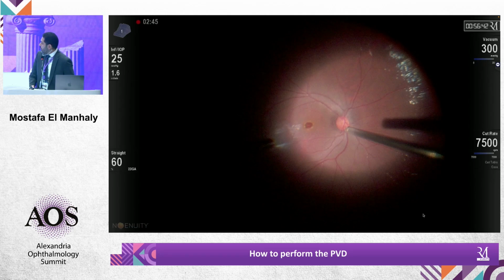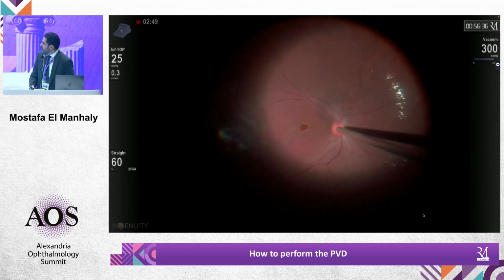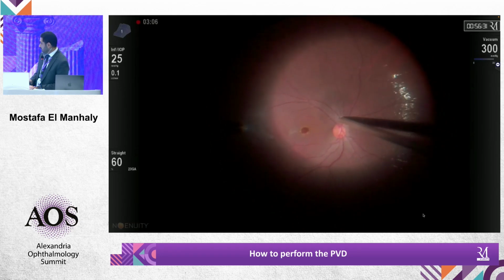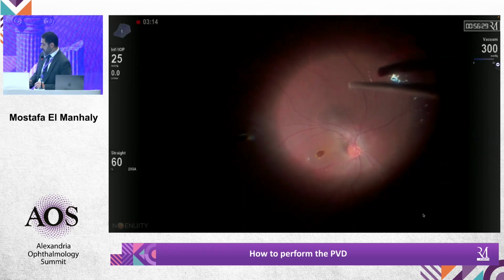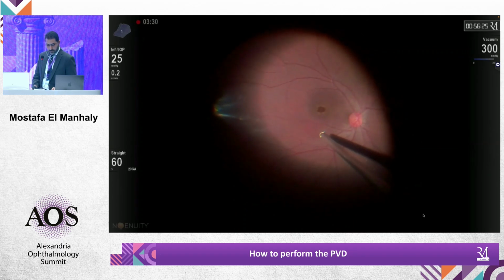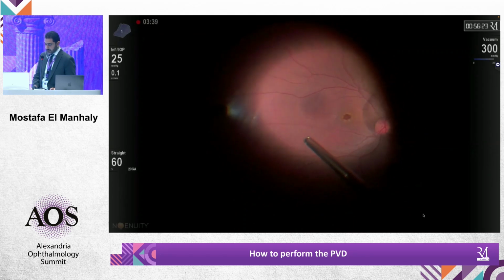So first to start, Dr. Mustafa, where do you prefer to start your PVD? I usually start midway between or at the temporal edge of the optic nerve head. If it is successful, okay. If not, I try other points around the optic nerve head.